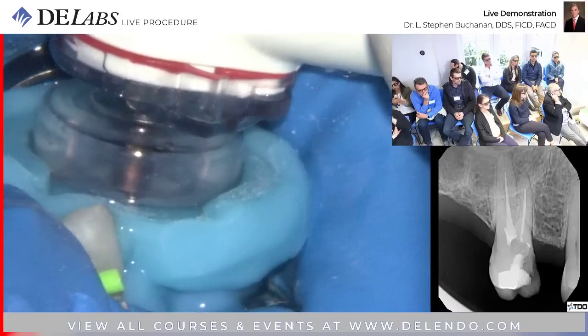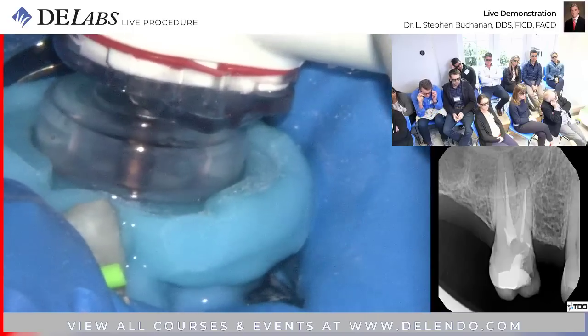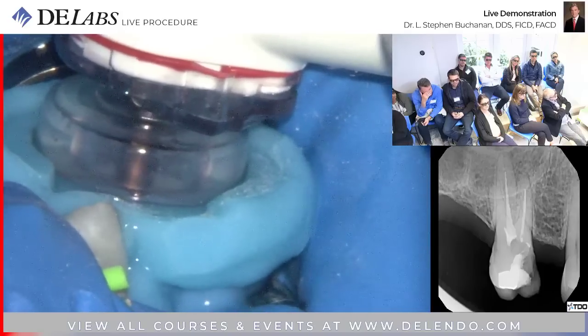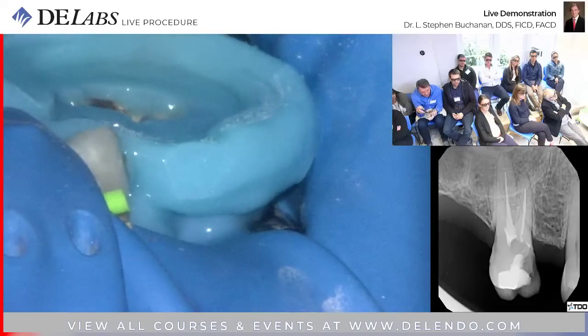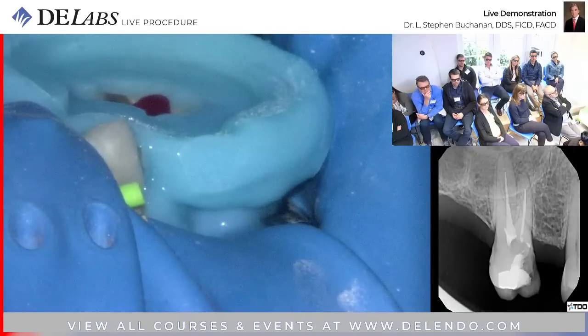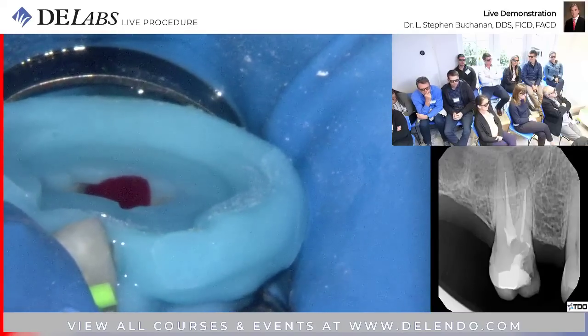And we're going to see bleeding coming out of the canals. When you first see that, you just go, oh, that's not good at all. You think hypochlorite's gone past the end of the root canal. All it is, there's a negative pressure environment there. If you put a straw on there with a seal and went for 8 minutes, all the capillaries open up. They're bleeding. It's not unexpected at all if you understand the mechanism of action.